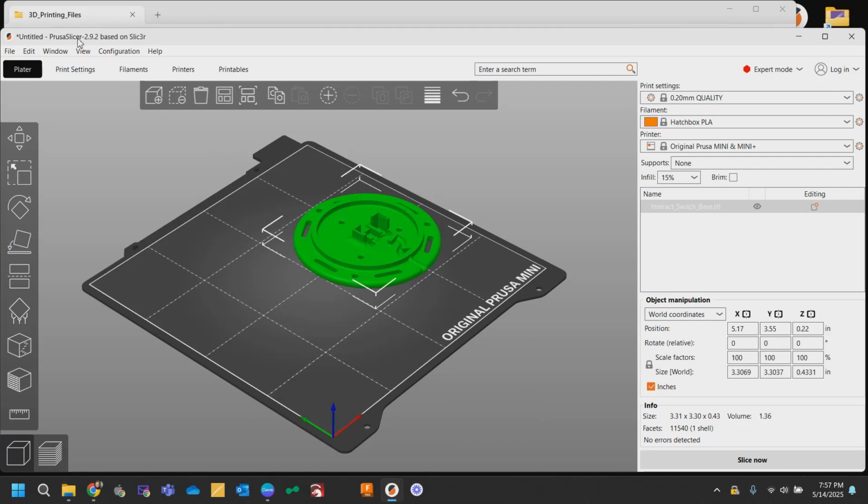I use Prusa Slicer because I have a Prusa brand 3D printer. A slicer program is going to take a 3D modeling file that you have, a .stl file. These types of files only have basically the information of the 3D structure, but it doesn't tell the printer how to print that structure. This slicer is going to add all of your instructions that you want to send to the printer for how it should print.